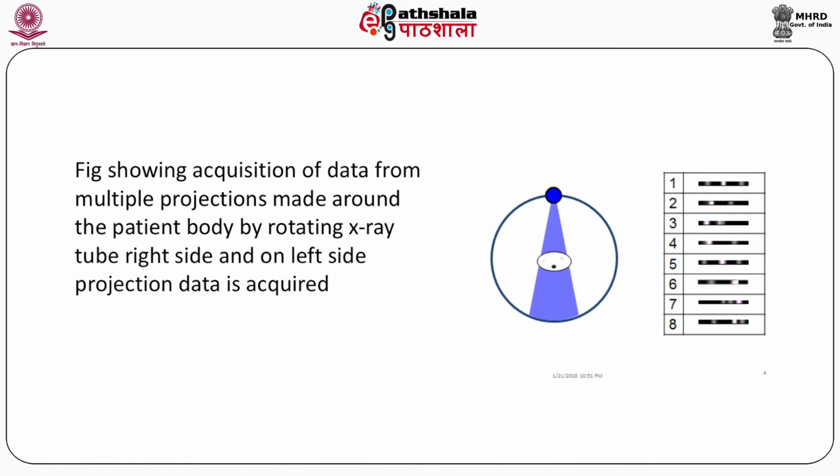So this data is acquired once the X-ray tube together with the detector assembly moves around the patient body, as I showed you in my figure.